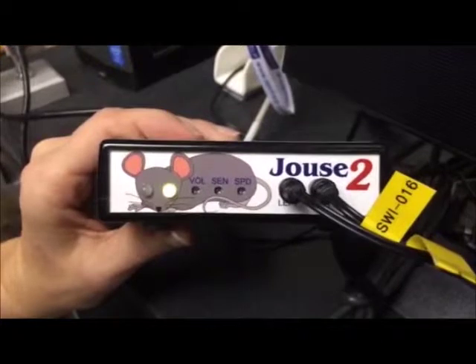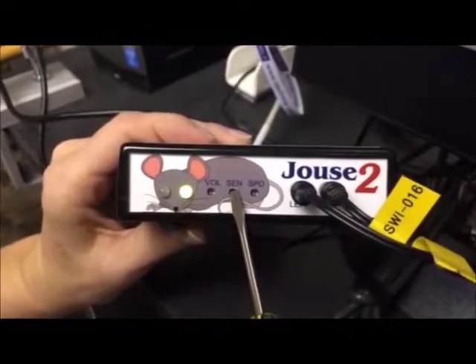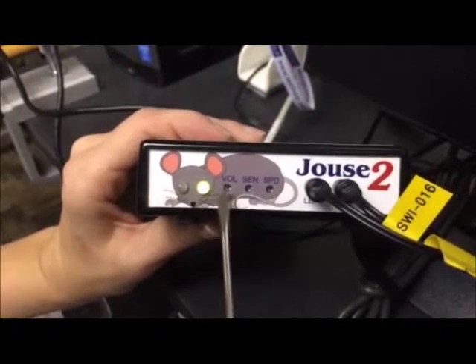Certain features can be adjusted easily on the front of the control unit by using a small screwdriver. You can adjust the Sip and Puff sensitivity, which changes how hard a person has to sip or puff. You can change the speed settings for text entry mode, and you can adjust the volume of the audio tones.